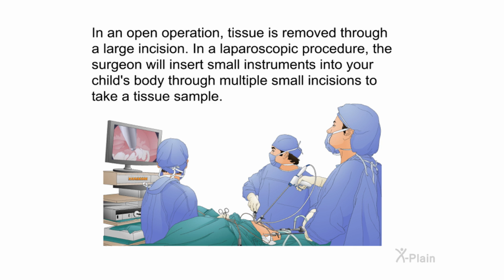In an open operation, tissue is removed through a large incision. In a laparoscopic procedure, the surgeon will insert small instruments into your child's body through multiple small incisions to take a tissue sample.